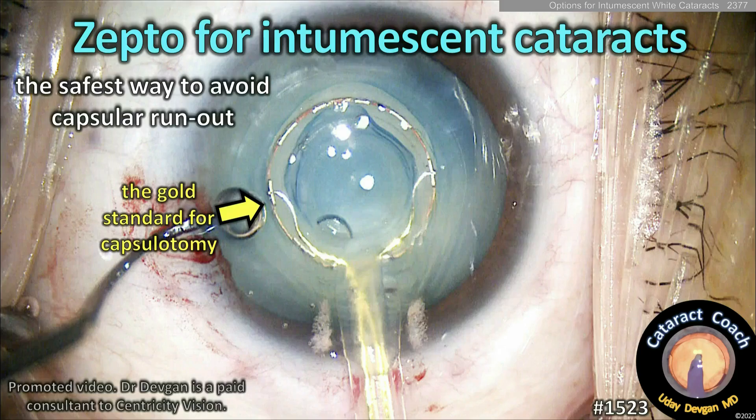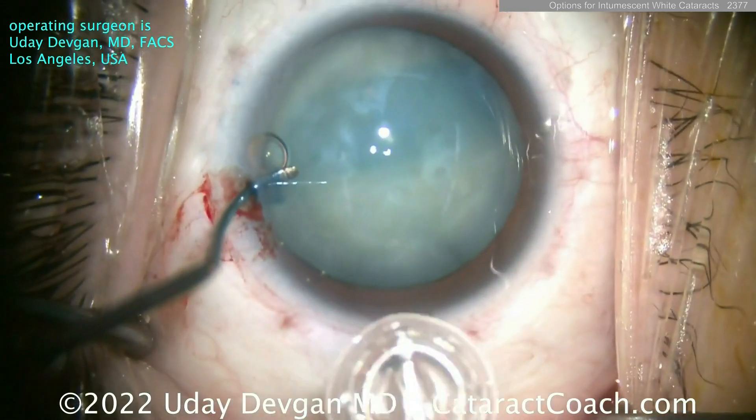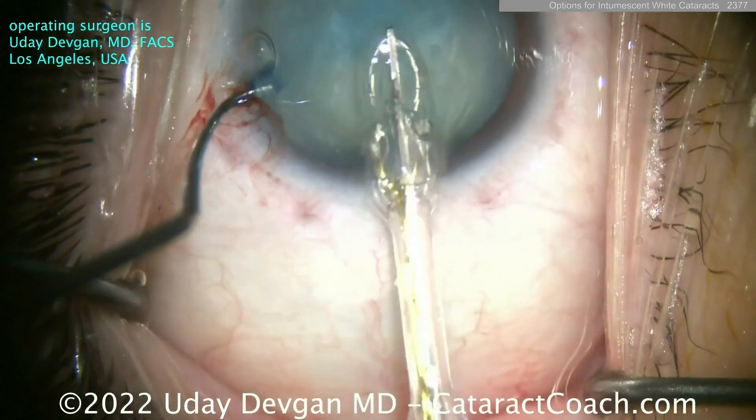So again, these are great options. Now there's another option which is the Zepto device — and I am a consultant to Centricity Vision who makes this device. Here's an intumescent white cataract; this is me operating. You can collapse this device and put it through a 2.2–2.4 mm incision.